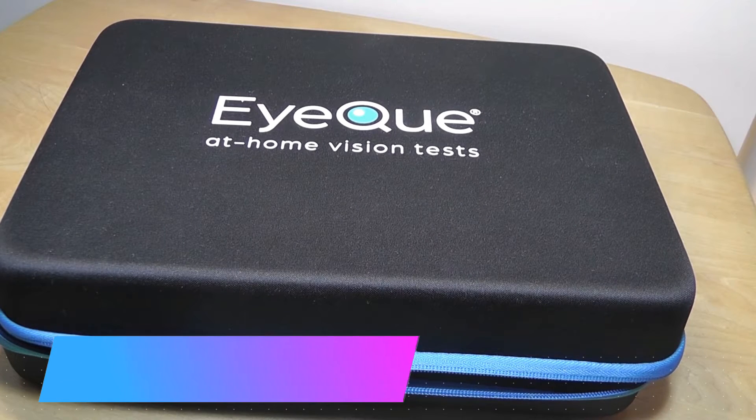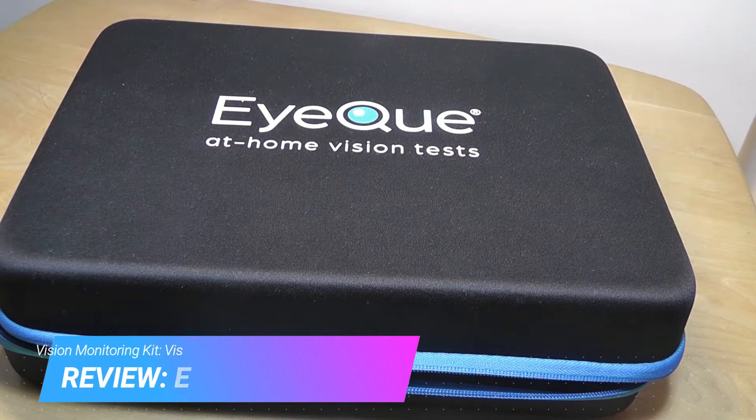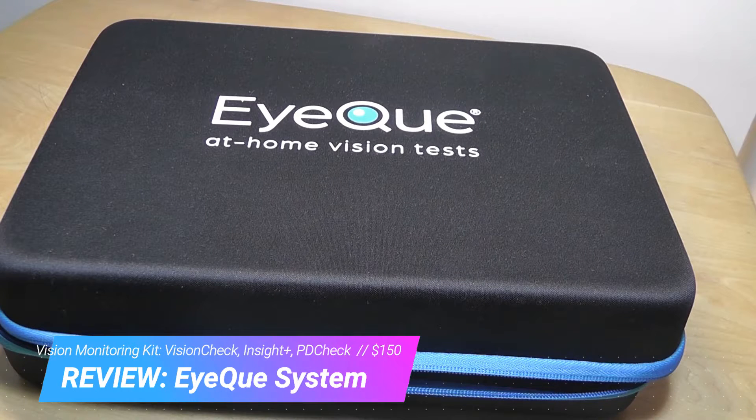Hey y'all, here at OSReviews. Today we're taking a hands-on look at a very interesting product called EyeQue. It claims to be a smart at-home vision testing system.